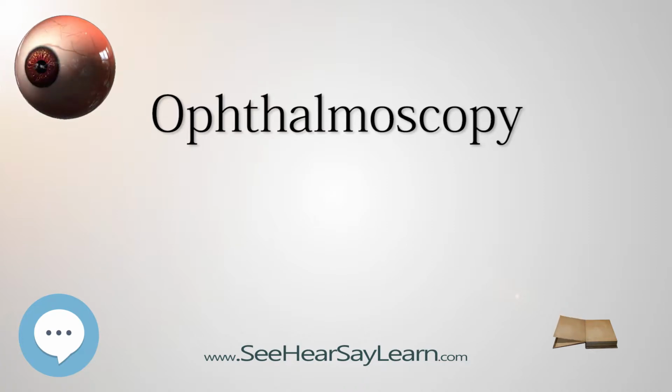Medical uses. Ophthalmoscopy is done as part of a routine physical or complete eye examination. It is used to detect and evaluate symptoms of various retinal vascular diseases or eye diseases such as glaucoma. In patients with headaches, the finding of swollen optic discs, or papilledema, on ophthalmoscopy is a key sign, as this indicates raised intracranial pressure, ICP, which could be due to hydrocephalus, benign intracranial hypertension, aka pseudotumor cerebri, or brain tumor, amongst other conditions. Cupped optic discs are seen in glaucoma.